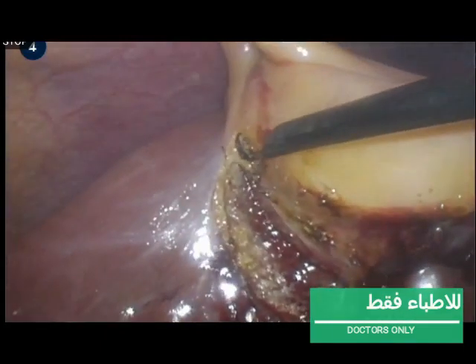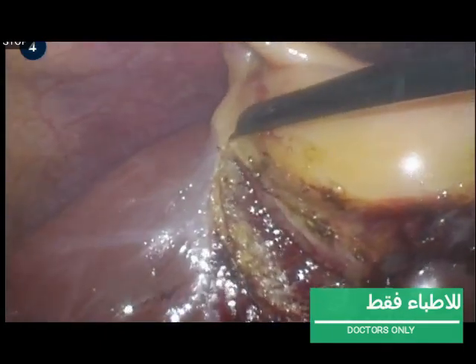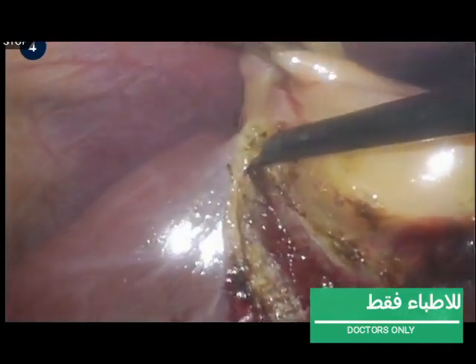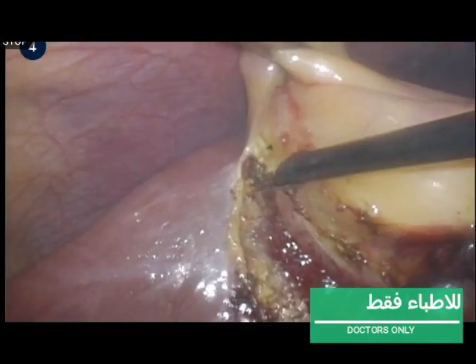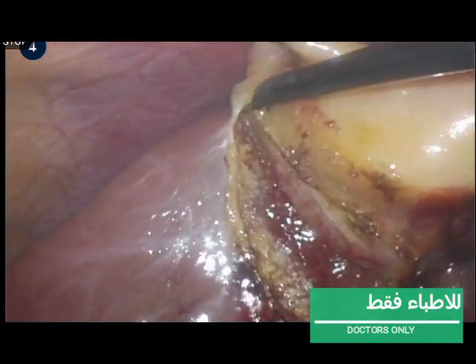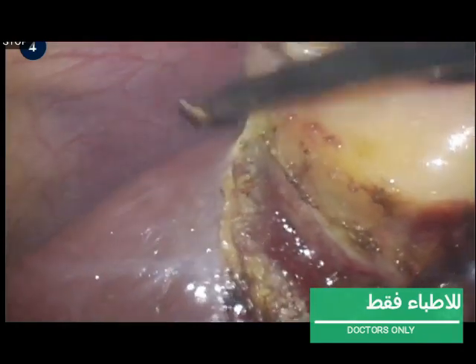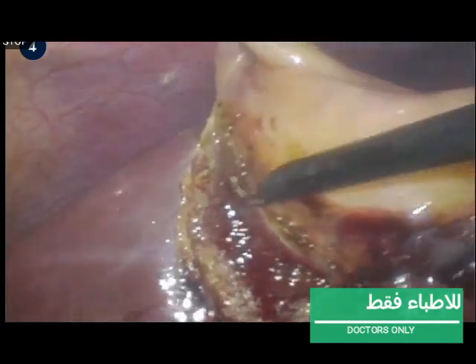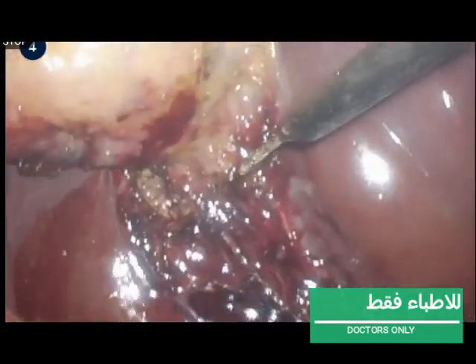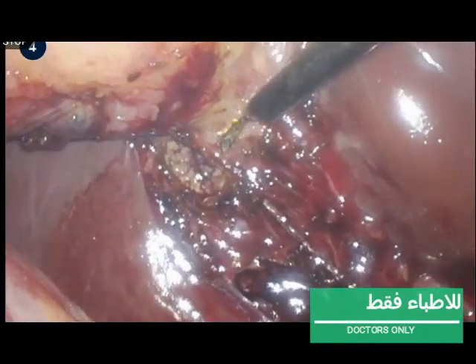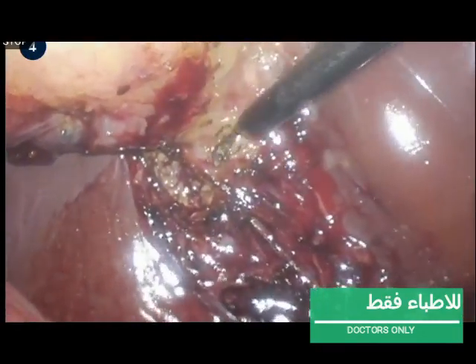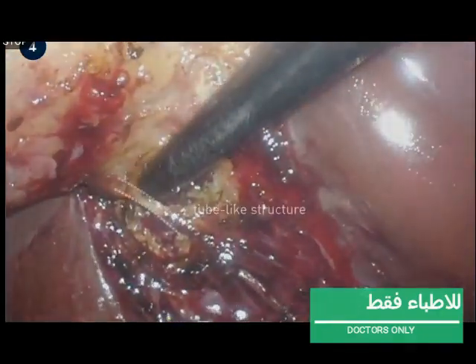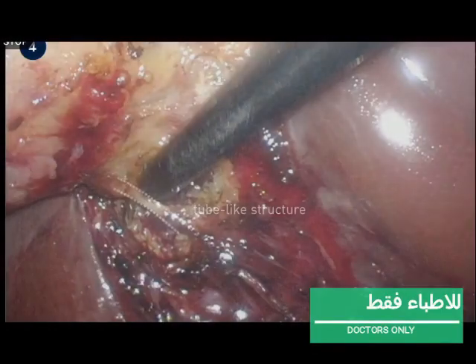When dissecting too much towards the liver, bleeding will occur. When dissecting too much towards the gallbladder, one can perforate the gallbladder with bile leakage as a result. Be aware of the possibility of aberrant bile ducts and additional arterial or venous structures when dissecting the gallbladder from the liver bed. Here, a tube-like structure is transected.